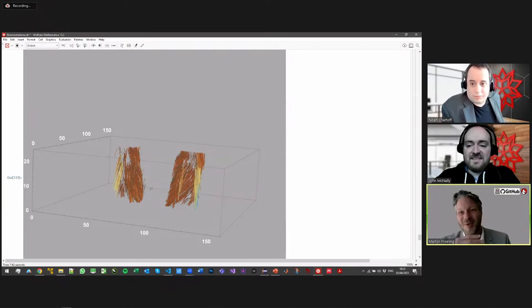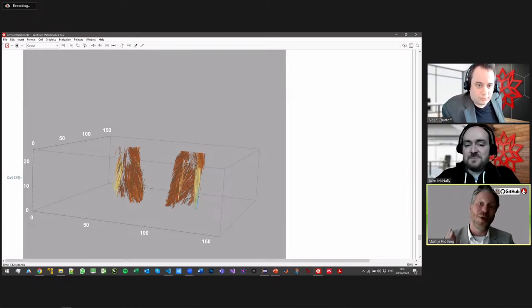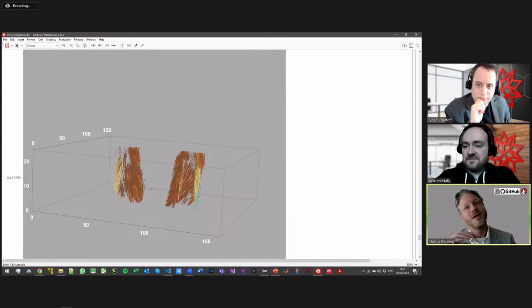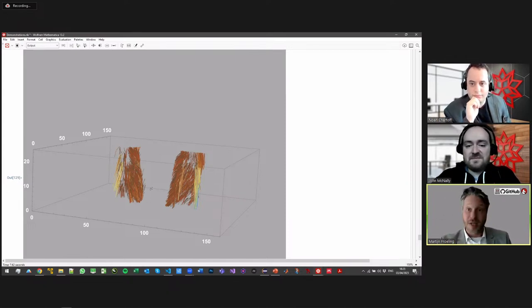Of course, we also have to do quantitative analysis. So we want to know something like, what's the distribution of length? What's the angle of these vectors compared to the bone, for example? So we're now up to this stage, and from here we're going to do, again, quantitative analysis on the things we derive from this. So it's layering functionality on functionality on functionality.